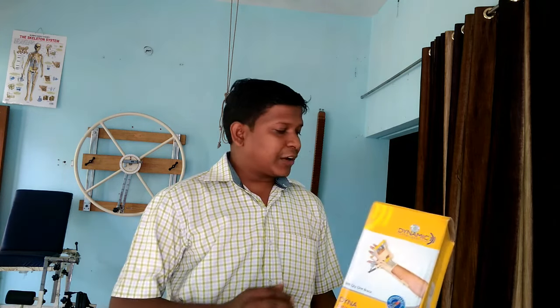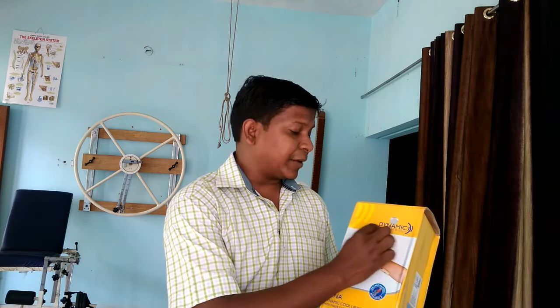The static cock-up splint is very important in treating contracture and tightness of the wrist flexor muscles seen in paralysis cases like hemiplegia. When the contracture and tightness of the wrist flexors is released and we can passively move the wrist joint, we can switch over to the dynamic cock-up splint. If there is already no contracture, we can straight away use the dynamic cock-up splint.